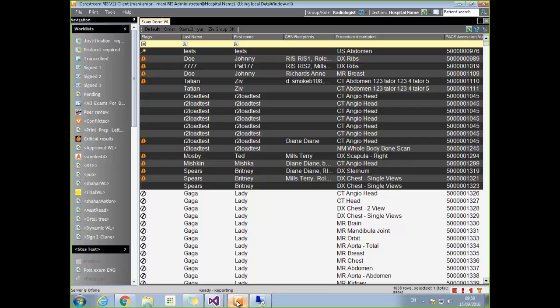It should be configurable, or having like a Big Brother account where I can look at all the conversations to see: are you working or are you chatting? We've already talked about that. We've actually been reading up a bit on the legislation in different countries. Not a moderator, but for chat statistics, an administrator able to view all chats for individual users.